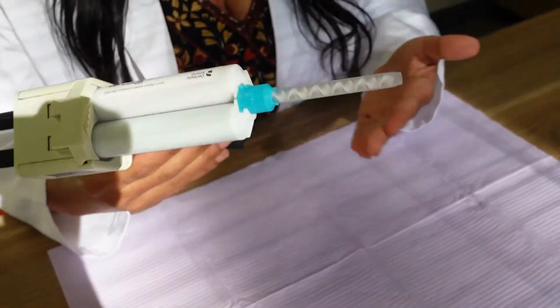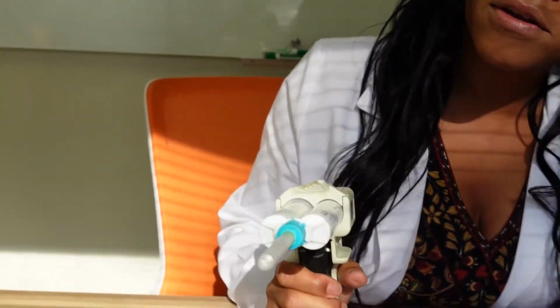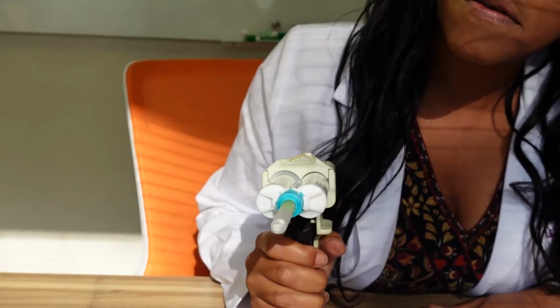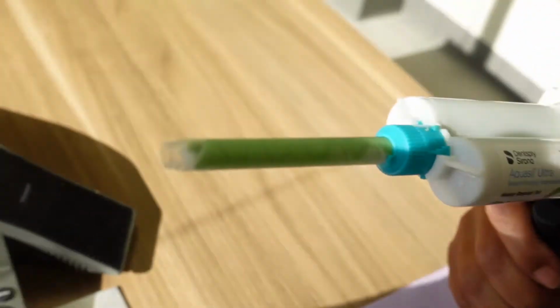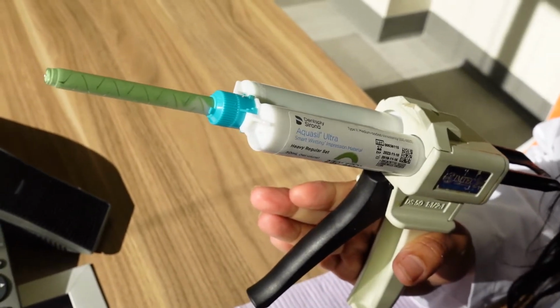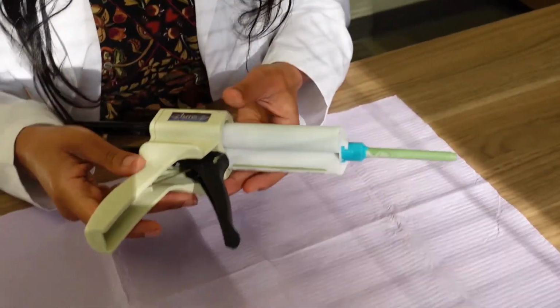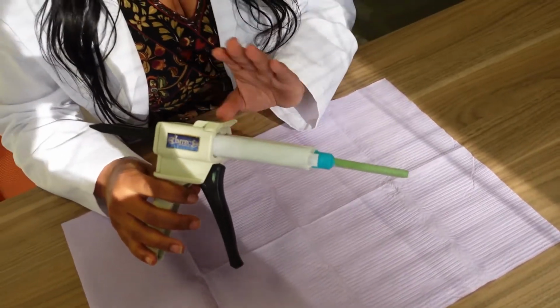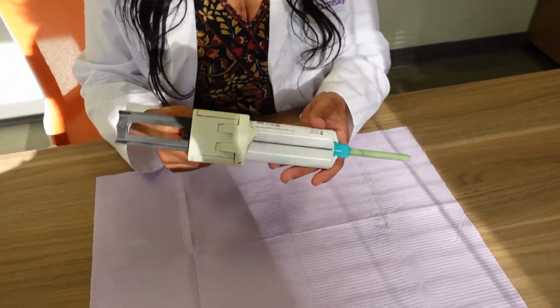This is actually how you dispense the material. You're gonna press it here, and you're gonna see it flowing. You see it is green? There we go. That's how you dispense the material. You release your hand, and it stops it. That is how you load a material gun and actually put the material in it, and dispense. All righty, so this is great.